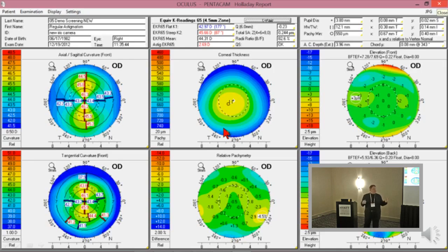And you also see that they break onto the same side. So this guy's got a little crab claw kind of a shape, not one that goes off this way and off this way. It goes like this. You can't bend an intraocular lens so that that axis does that. So the quality of this guy's vision is going to be a little softer, just because it's not all regular astigmatism. All right, now that's best to see on the sagittal map. The tangential map is much more sensitive, about 2 to 1.